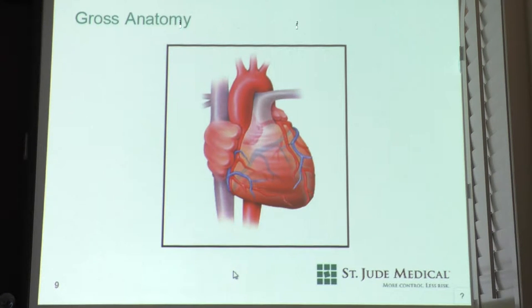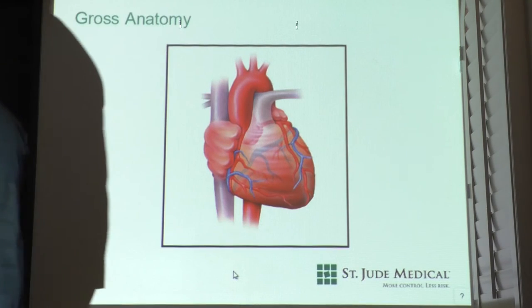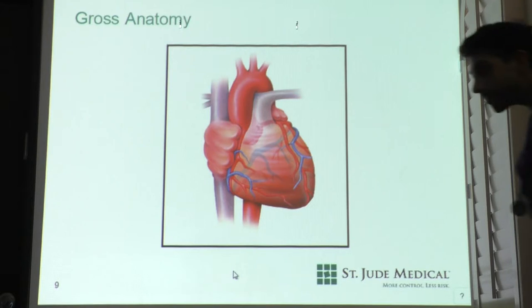So what view are we in here, first of all? We're going to talk about both fluoroscopic and anatomical views, as they all have abbreviations. So what options would we have? Has anybody seen x-ray or fluoro? AP, right? This is AP, on a normal person's heart with normal rotation. So what's the big red thing running from the bottom to the top with three branches at the top? On the left-hand side, the part that looks kind of like a seashell is the atrium, and specifically the right atrial appendage flopping over the top there.